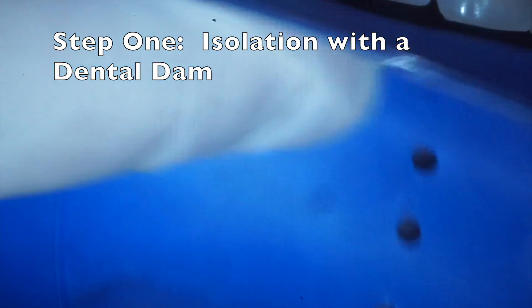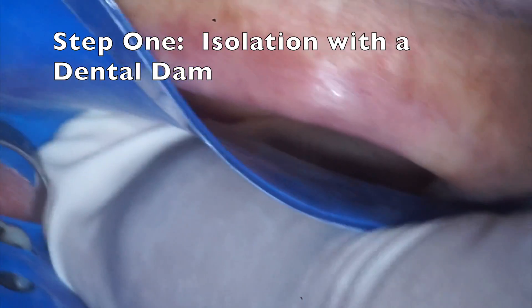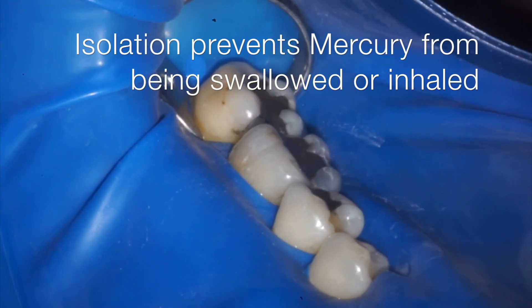The first step is to place a dental dam over the teeth. This isolates them from the rest of the mouth and prevents any of the mercury from being inhaled or swallowed while it's being removed.